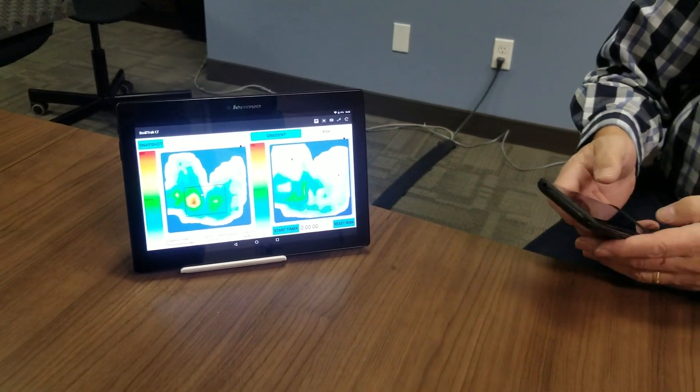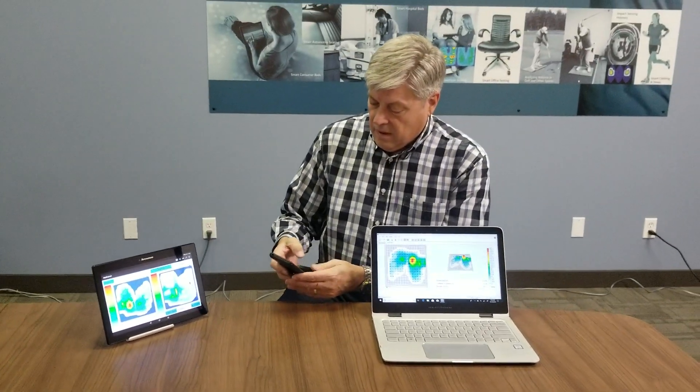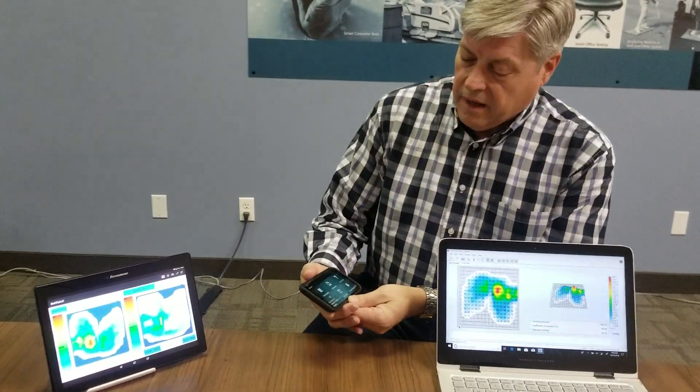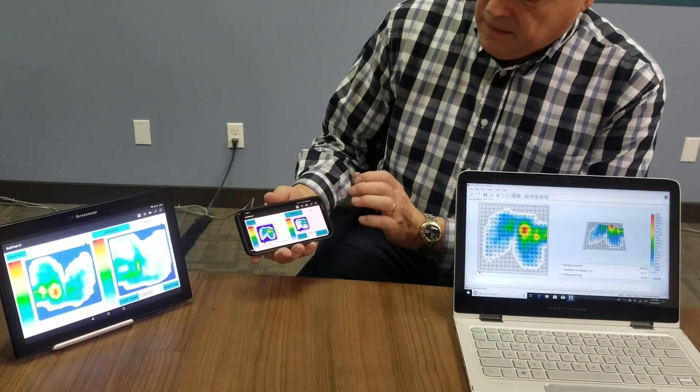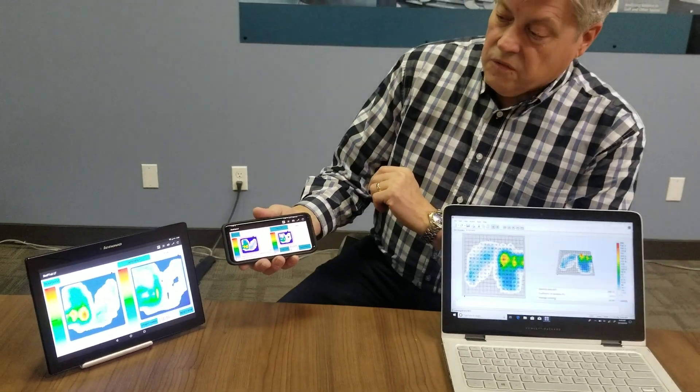And just for fun, we'll see if I can get it on my phone here. This is a Galaxy S8. Same BodyTrack Lite software. And there you go.